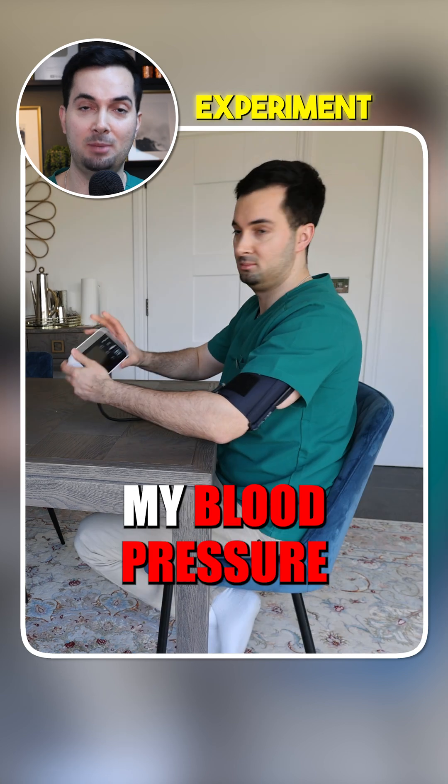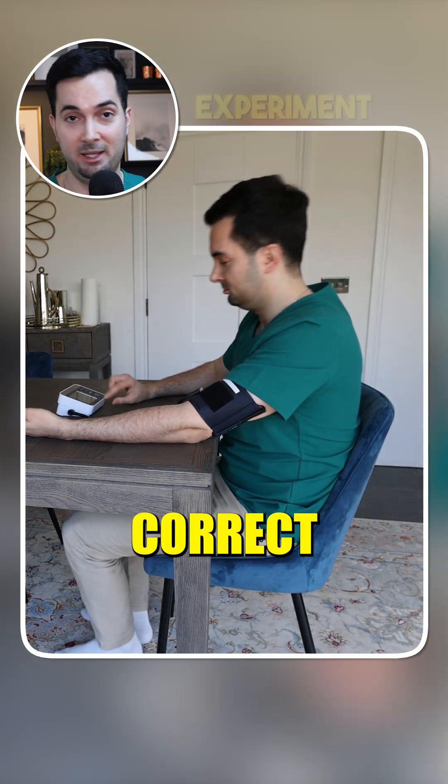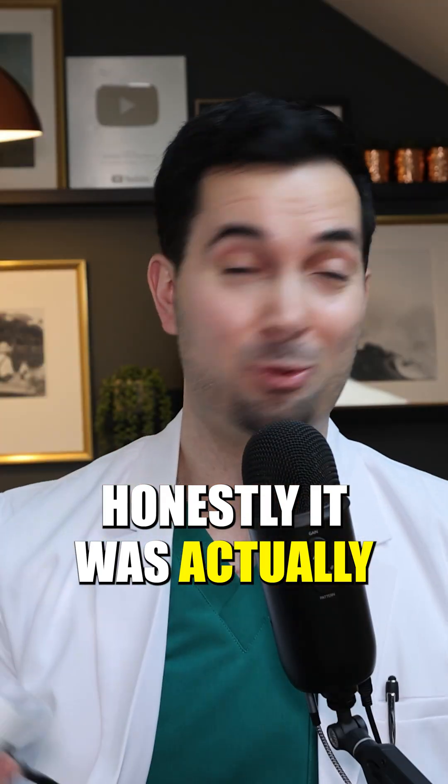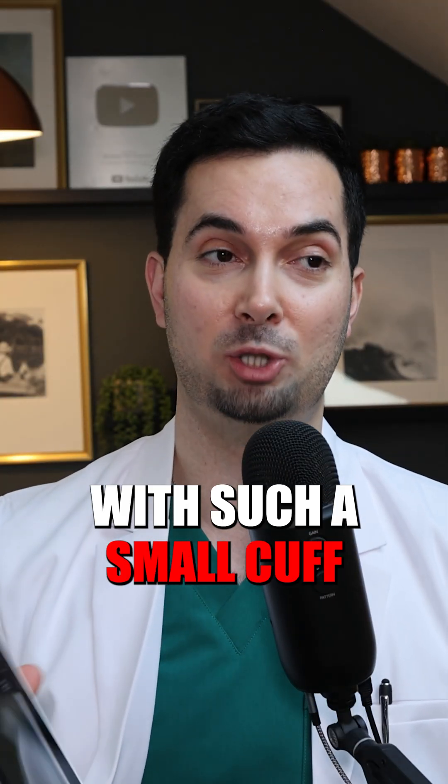As you can see in this video, whilst I'm taking my blood pressure, I'm doing everything correct. The only difference is the cuff — it's the small adult cuff that's too small for me. Honestly, it was actually quite painful having my blood pressure done with such a small cuff.